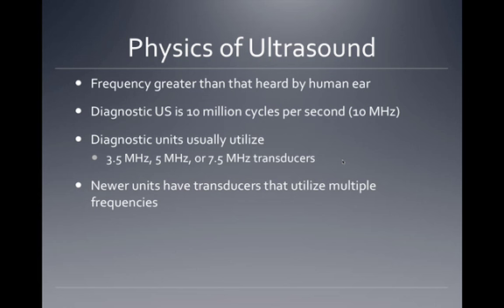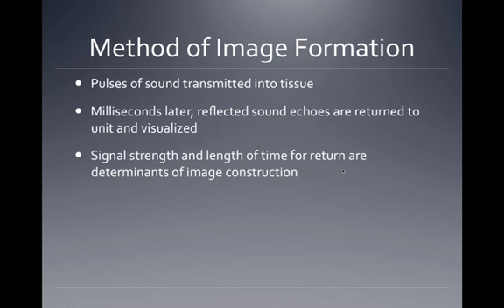I just don't know. Okay, so just like our therapeutic ultrasound, we have transducers that can utilize a multiple of frequencies. So within the software, you're able to change your 5 megahertz sound head down to 3.5 megahertz, maybe up to 7. And then you've got a 10 megahertz sound head, and that one maybe will range from 8 to 12 or something like that. So you're able to just change that a little bit so you can improve your resolution or change your depth.